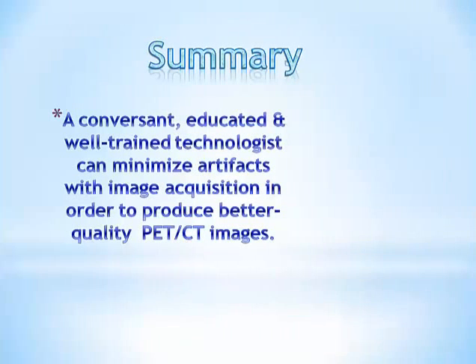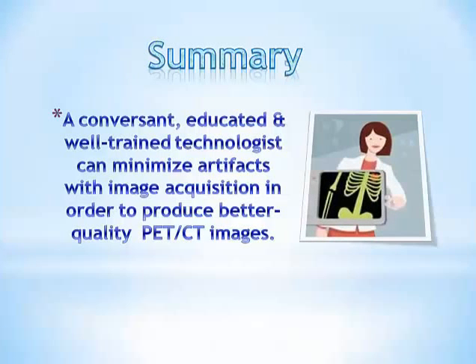This is what I want you guys to take away: no matter what we are saying, at the end of the day, we end up with the technologist, him or herself, watching their education, their training, their professionalism. So a conversant, educated, and well-trained technologist can minimize artifacts during image acquisition in order to produce better quality PET-CT images.